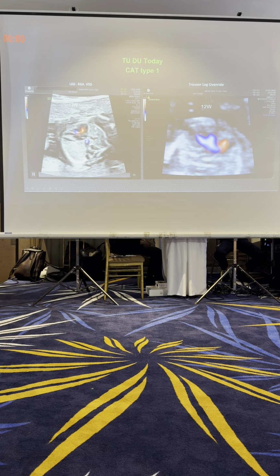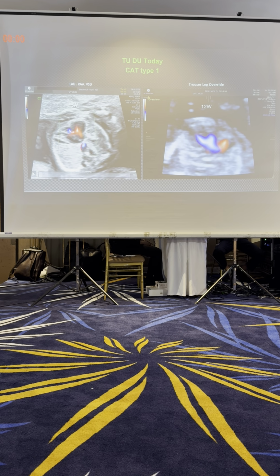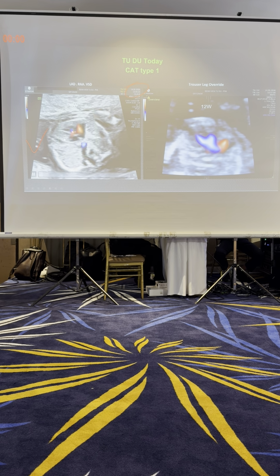This is a patient I scanned today, showing the aorta sitting to the right of the spine, so that's the 14th of May, this morning. And this is the aorta, which is sitting to the right of the spine. And when you look at the heart, the apex of the heart is rotated to the left. So I've got two findings in this baby. I've got a left axis deviation and I have a right aortic arch. These are the clues that there's an abnormality.